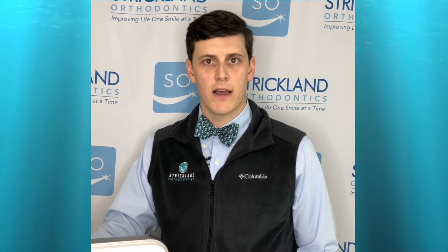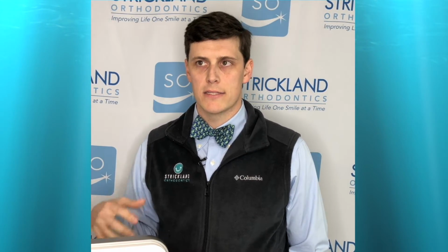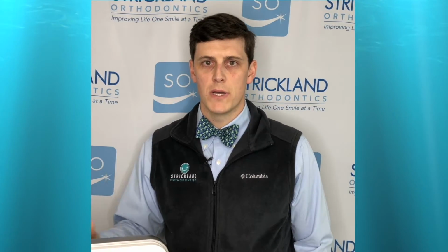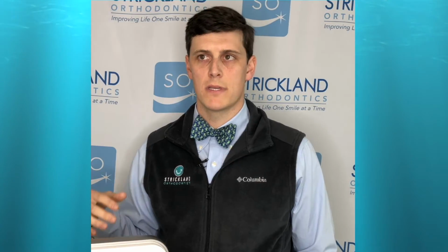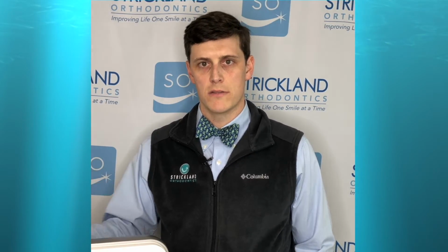Clear aligner therapy has improved drastically over the last 20 years, especially in the last 5 years. The technology has grown tremendously. And the AI that's helped planning a lot of the treatments has also improved, but it's still not near adequate to plan the tooth movements in a human that's growing, changing, and the biology that goes along with it.